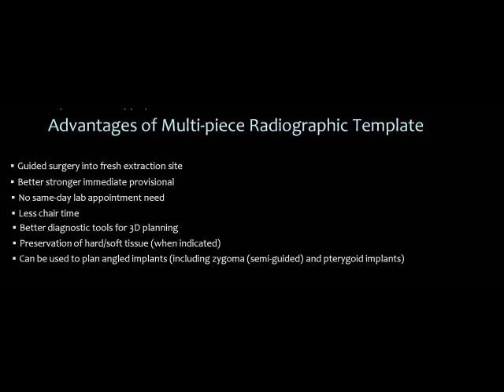So what are the advantages of a multi-piece radiographic template? Precise implant osteotomy preparation. By having this precise implant osteotomy preparation, we're able to have a very accurate hole so the implants can go in tighter.